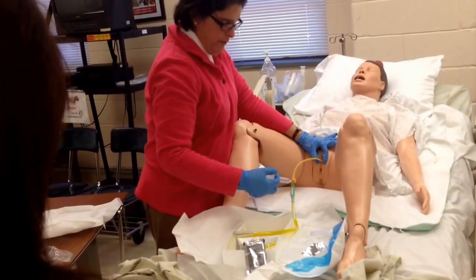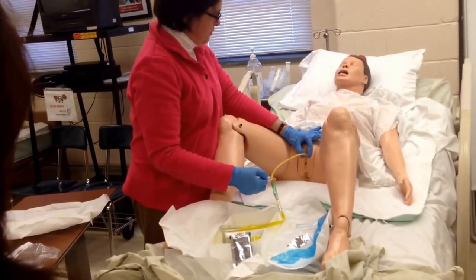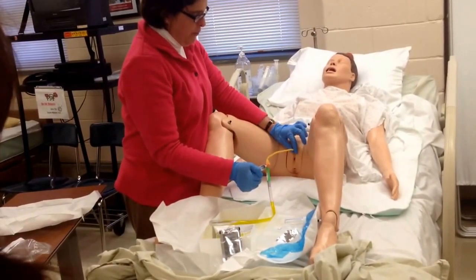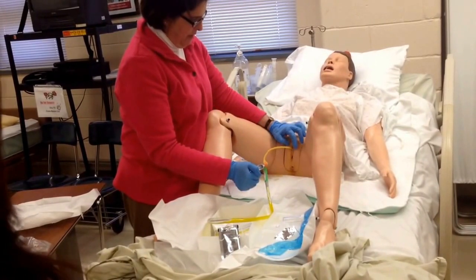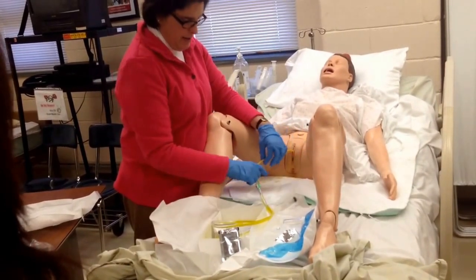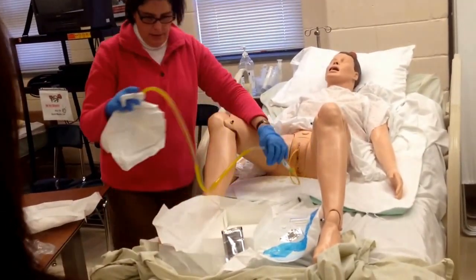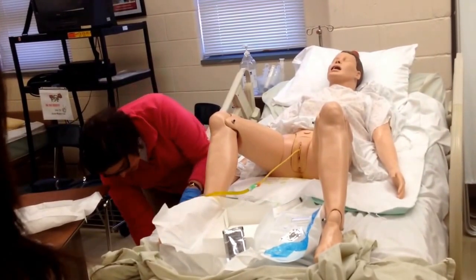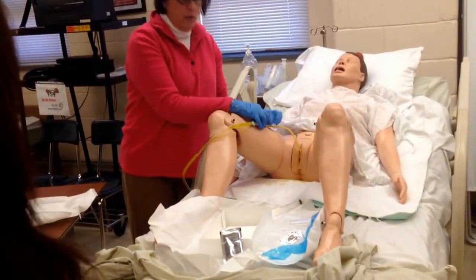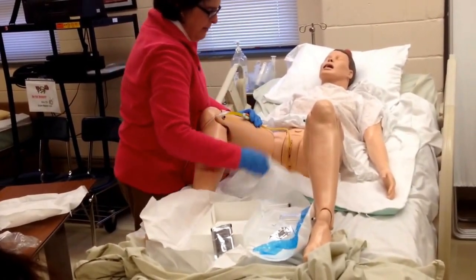So what you need to do now, once you've got that going, is insert another inch, okay? And then you are going to inflate the balloon and watch your patient's expression as you do this, because if the catheter balloon is being inflated, the patient's facial expressions are going to change. While holding down the plunger on the syringe, you are then going to pull back until you meet resistance. Okay. It's overfilled. So what this means is that once you feel resistance, the catheter now is resting on the bladder neck. So then you would hold this and put this down below the patient. You would then attach this to the leg with that strap or with the StatLock, right here on the leg.